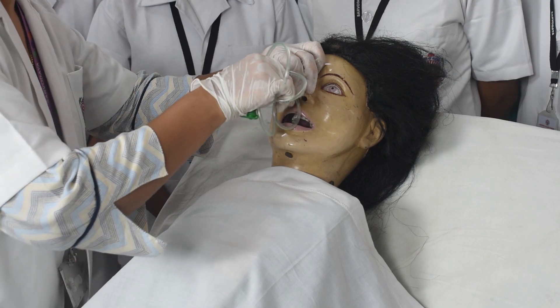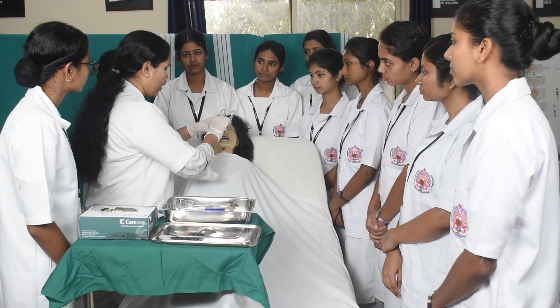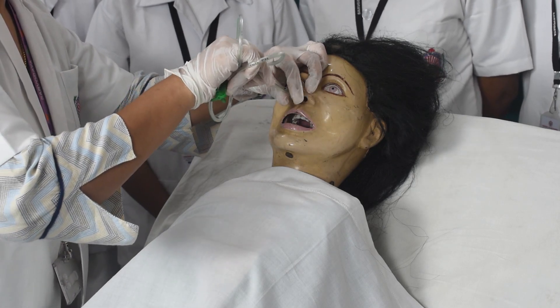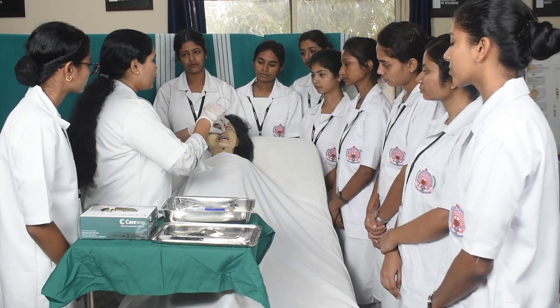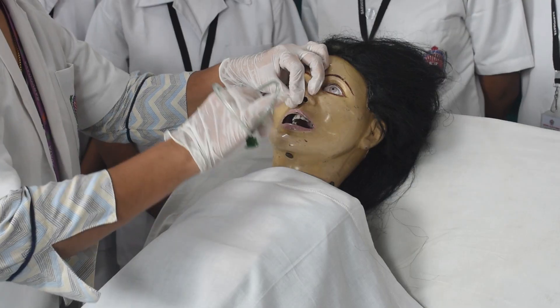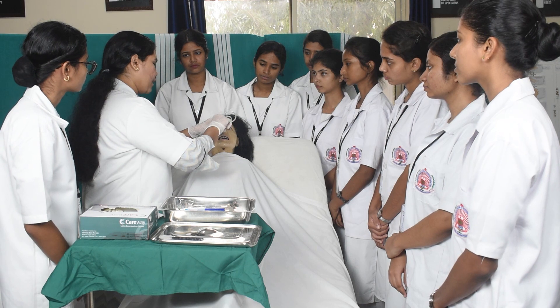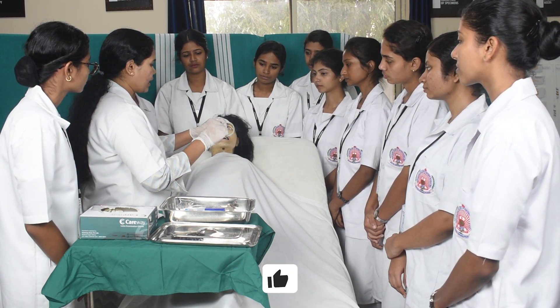After lubricating, gently insert the ryle's tube through one of the nostrils. Make sure the tube is not getting coiled inside the mouth of the patient. Gently insert the tube without exerting any force. If you are feeling any restriction, pull the tube one inch backward.